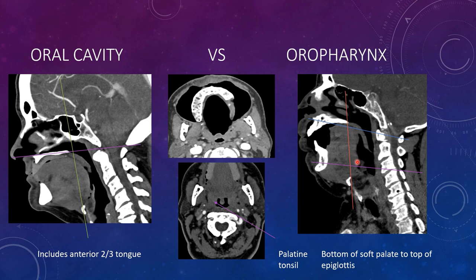On the axial view, you want to see these palatine tonsils, usually symmetric appearing, above the level of the base of the tongue. The retromolar trigone is my favorite location in the head and neck. If you stick your tongue in the back of your mouth, that retromolar trigone is the space between the bony areas at the top and the bottom.